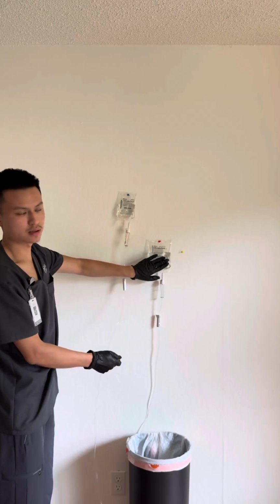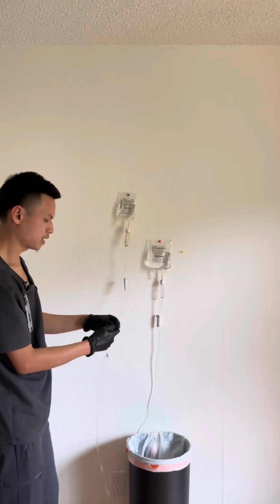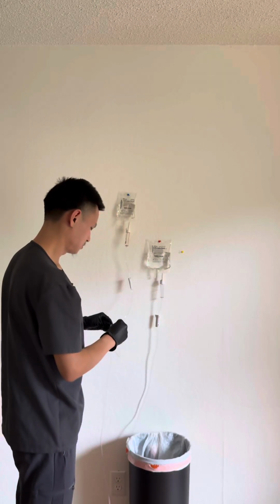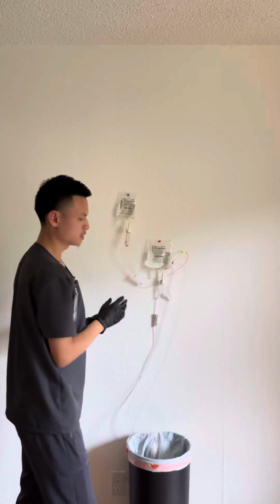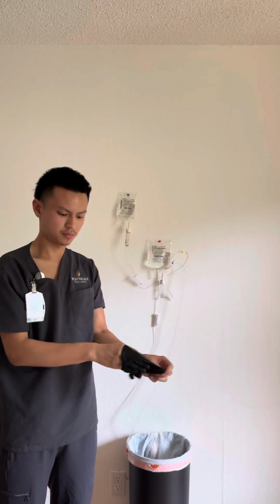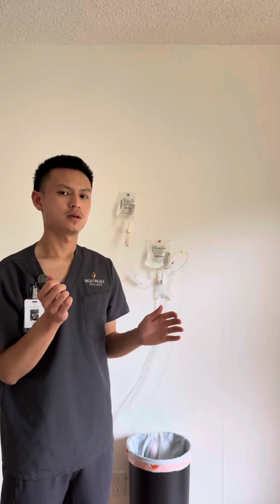So my fluid is at 38 drips per minute. Medication is 100 drips per minute. It is flowing. I will connect this to the patient's IV site. Once that is connected, I am going to remove my gloves, perform hand hygiene, exit the patient's room, and document that the intravenous fluids and medication administration is complete.